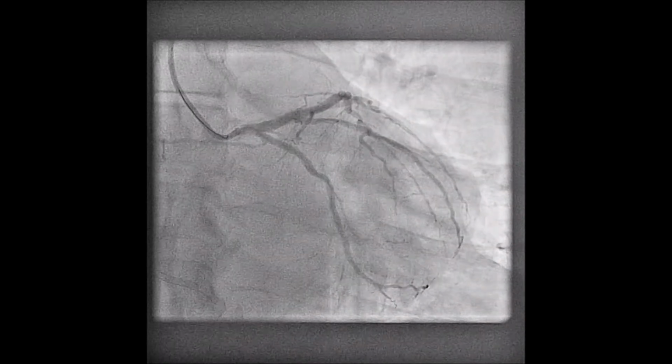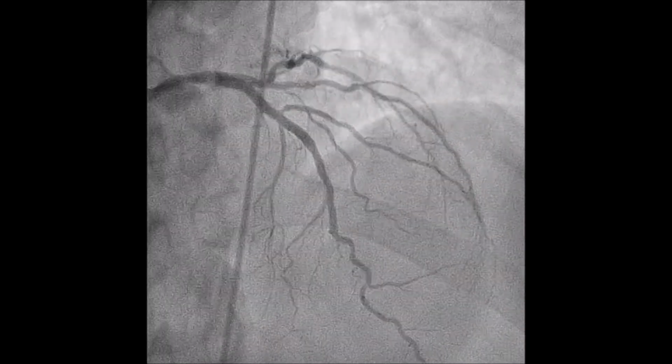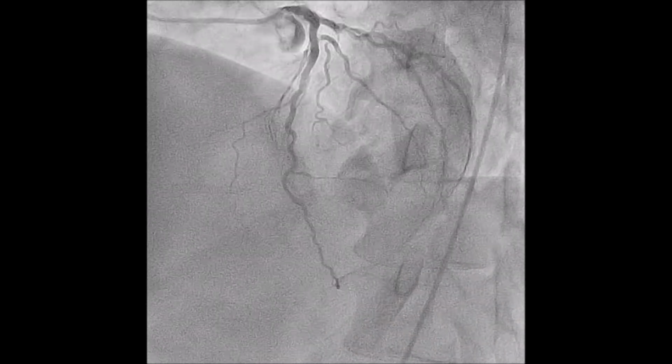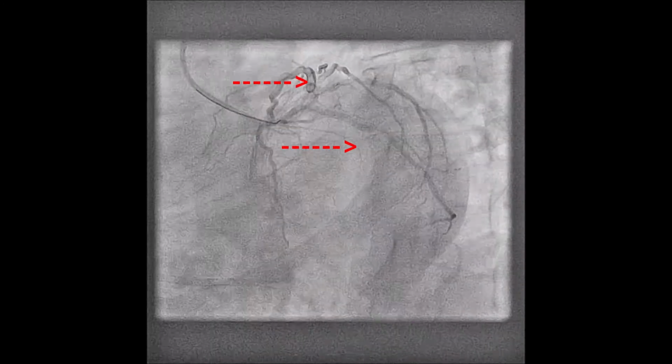In this case, primary angioplasty was performed. As you can see, the branches of the left coronary tree are open. It is angiographically lesion-free, and no restenosis exists on the previously implanted stents in the anterior descending and circumflex arteries.